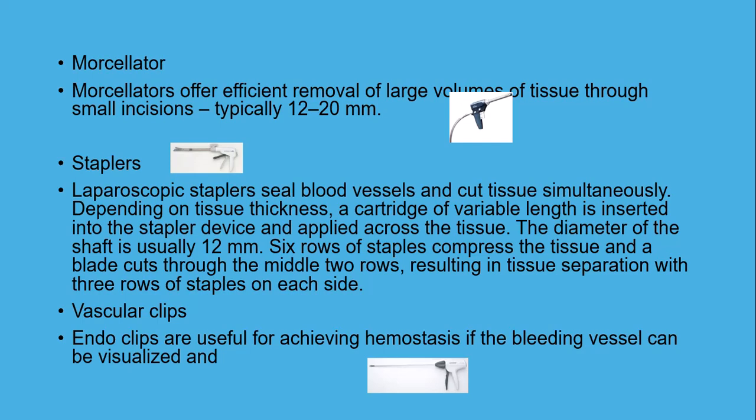Morcellator. Morcellators offer efficient removal of large volumes of tissue through small incisions, typically 12 to 20 millimeters. Staplers. Laparoscopic staplers seal blood vessels and cut tissue simultaneously. Depending on tissue thickness, a cartridge of variable length is inserted into the stapler device and applied across the tissue.